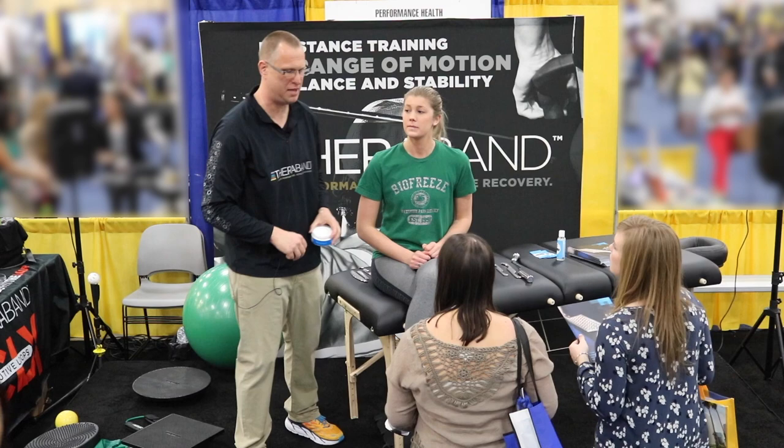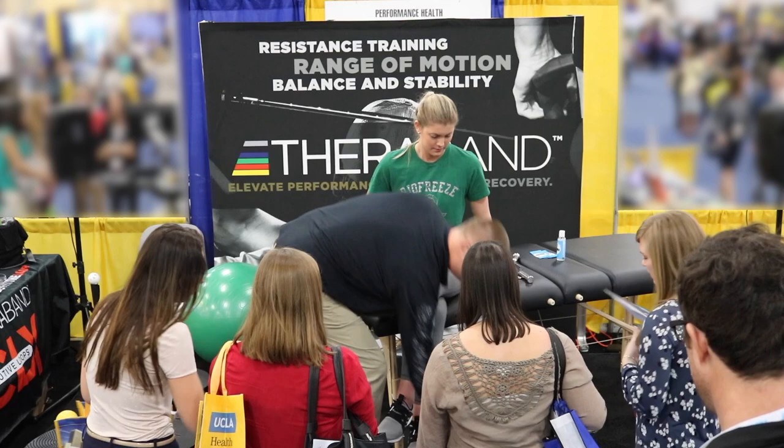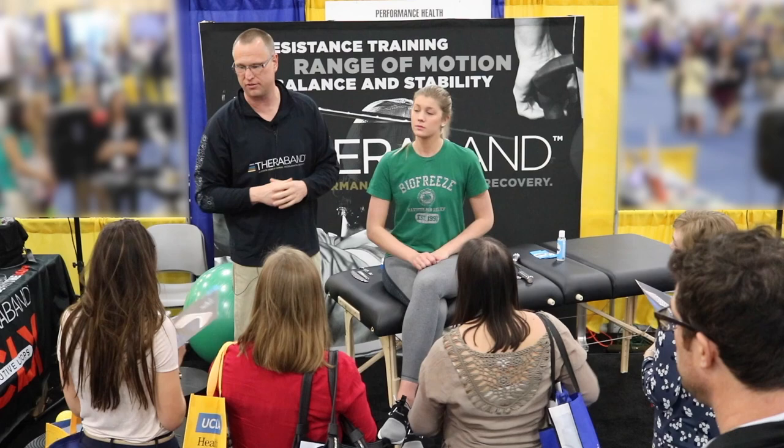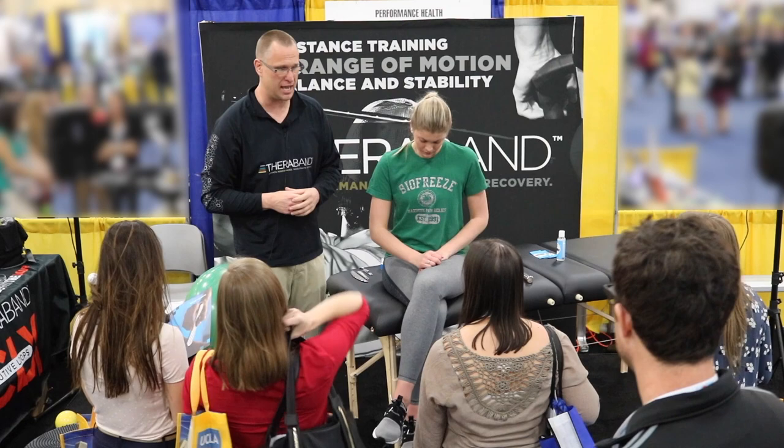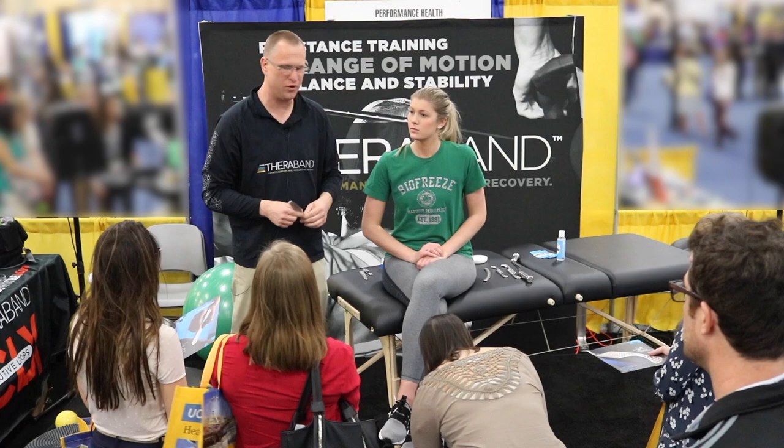What we want to talk about today is the role of instrument-assisted techniques in pain management. My name is Sean Berger, I'm a physical therapist in private practice in northern California. I have been involved in instrumentation for over a decade, utilizing metal, plastic, or other forms of instrumentation for soft tissue work.